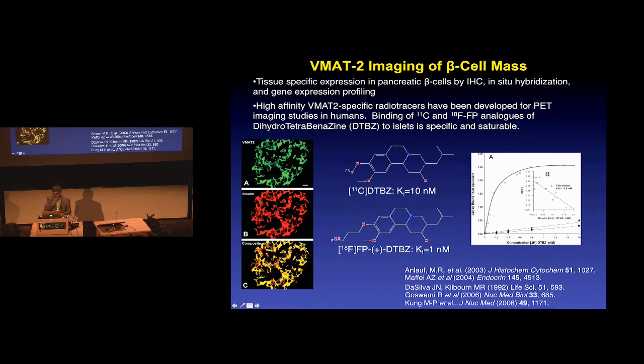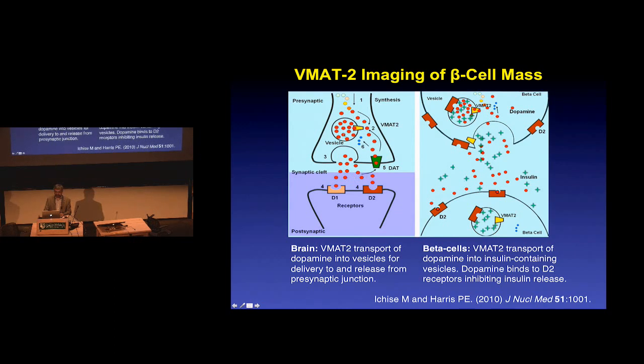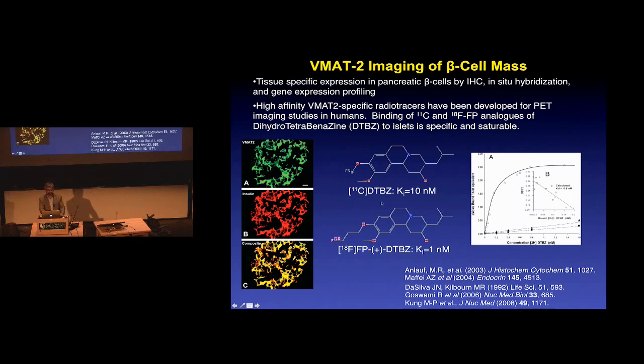And now you need a tracer for that. And now this is where it got interesting, because the same target was being used in the brain to look at the presence of vesicles, that is the presence of presynaptic neurons, something which is tremendously reduced in Parkinson's disease. There were 2 tracers that were developed, dihydrotetrabenazine, DTBZ, and another analog of that, fluoropropyl. The dihydro is labeled with carbon-11, that's that 20-minute half-life. This one is a fluorinated version, so it's a slightly different molecule, an analog. It's got that 2-hour half-life, so it has a little bit better statistics out later. And both of these compounds had good affinity. The affinity number is lower. That means higher affinity for the fluoropropyl DTBZ.